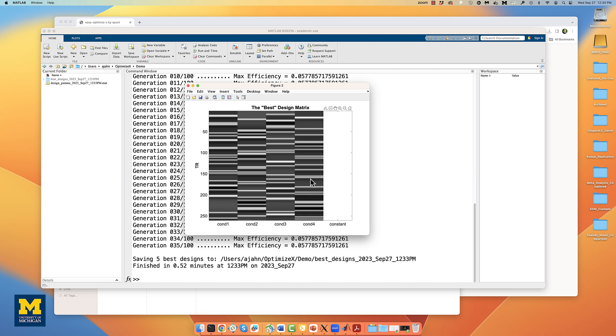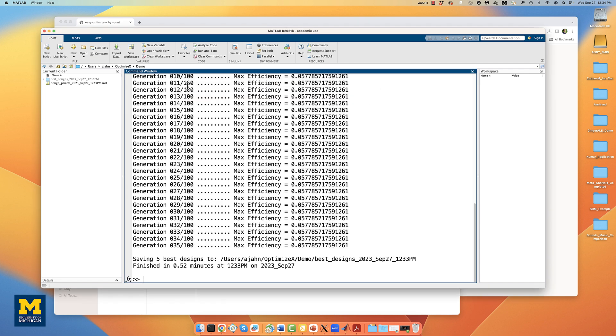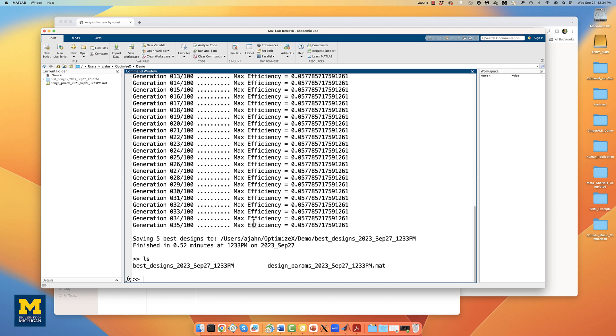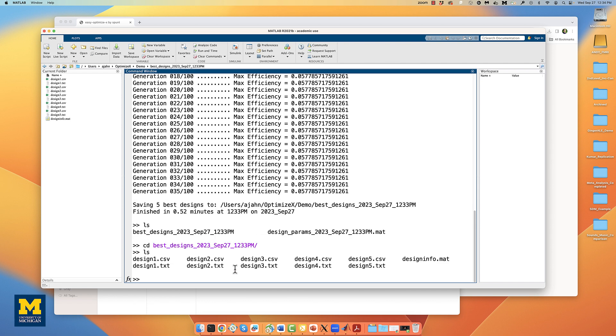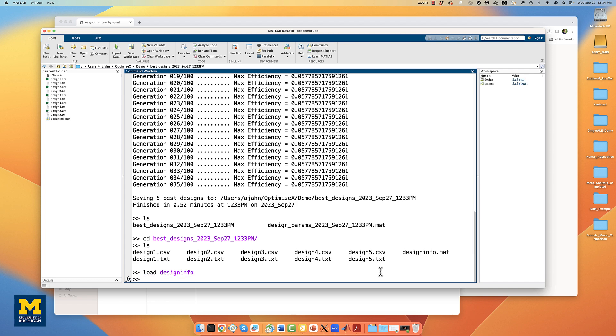Let's begin by evaluating the optimized design that you just created. Within your current directory, your design should have been saved in a subdirectory called bestdesigns underscore, and then the date when you ran these simulations. Navigate into that directory, and you will see it contains both .txt and .csv files, essentially the same thing, containing timing schedules for the top five designs that you specified. You also see a structure called designinfo.mat, which you can load by typing load designinfo.